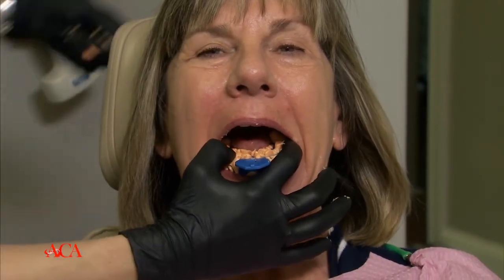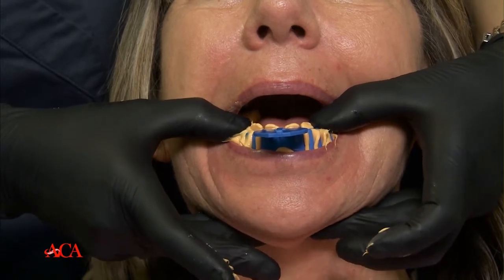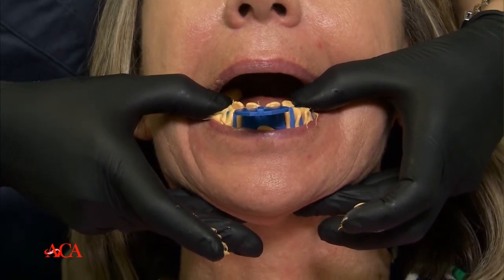And notice where my fingers are here. I've really got good control right on top of the premolar area. I'm not going to hold it in front of the handle. And I also have my hands underneath the chin just to help keep it from sponging up, or lifting a little bit. So I've got really good control.